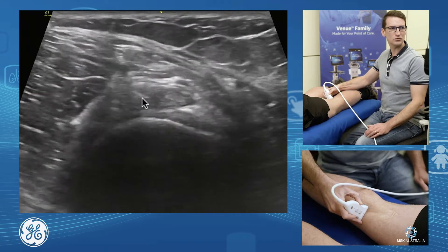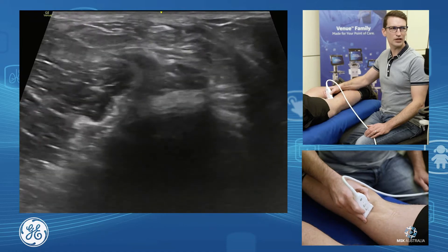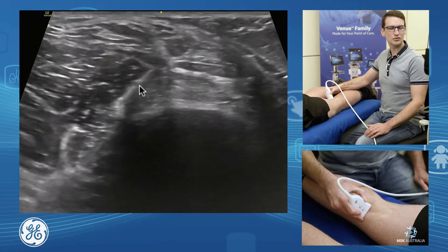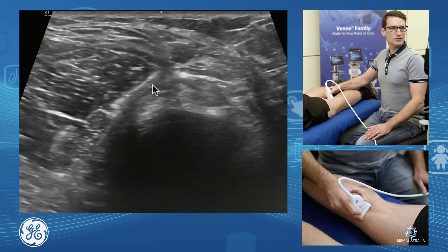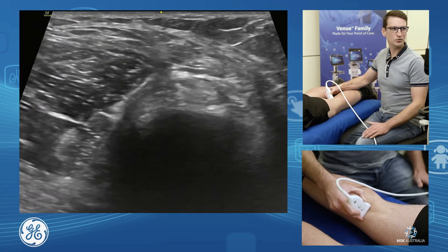That's our semi-membranous. Coming back into short axis on that and coming back up, we can see here our medial gastrocnemius tendon — medial gastrocnemius and our semi-membranous sitting next to each other. And this is where we have our semi-membranous gastrocnemius bursa, or this is where our Baker's cysts form.